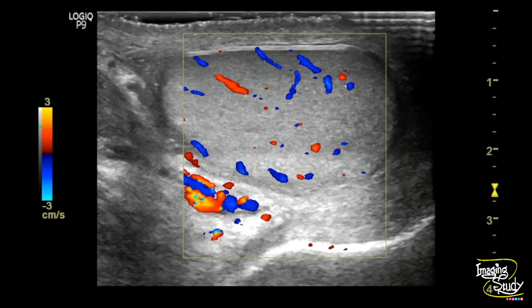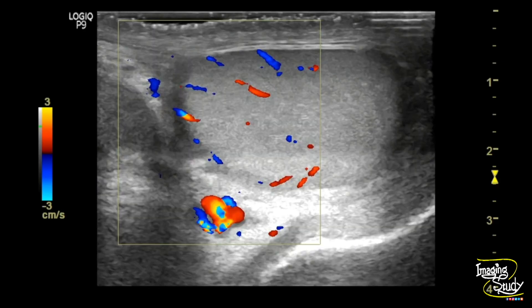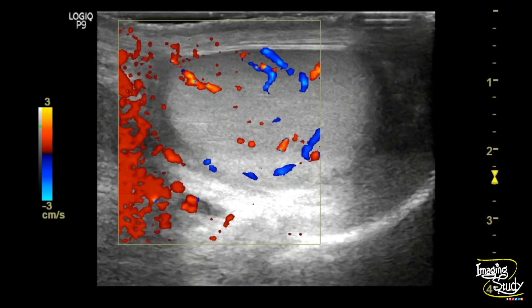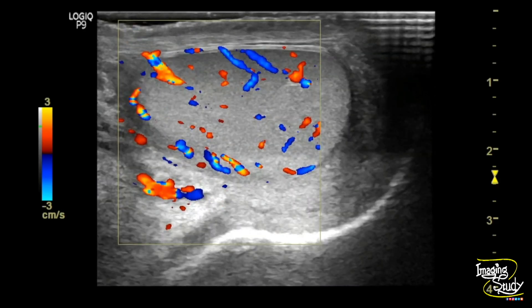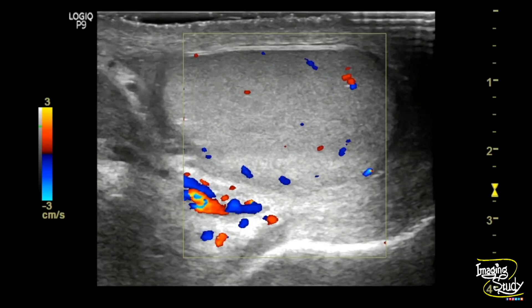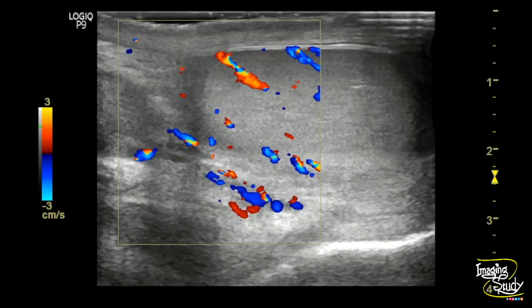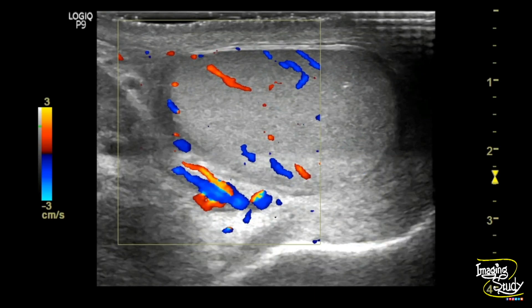When we put the color Doppler, you can see in low PRF setting the normal testis shows a good amount of blood flow. We'll compare this blood flow with the other testis to exclude testicular torsion.